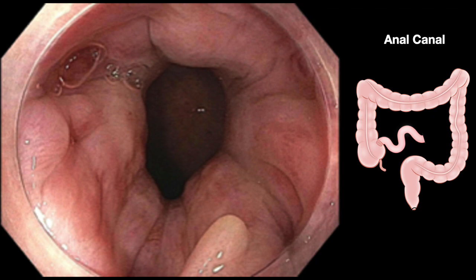So in this video, we have learned about the anatomy of the colon as we examine using the colonoscope, and different regions of the colon and rectum. And I hope this is useful.